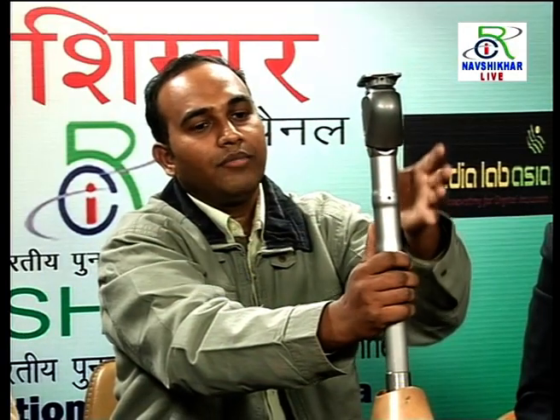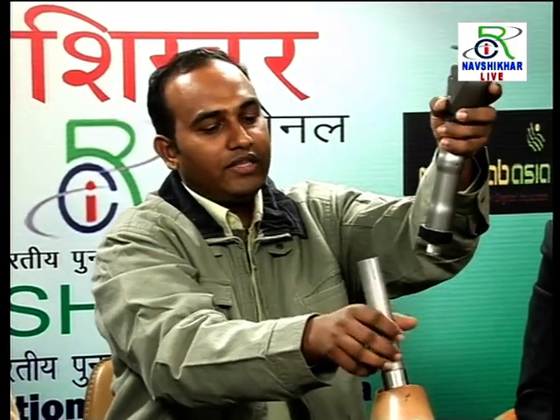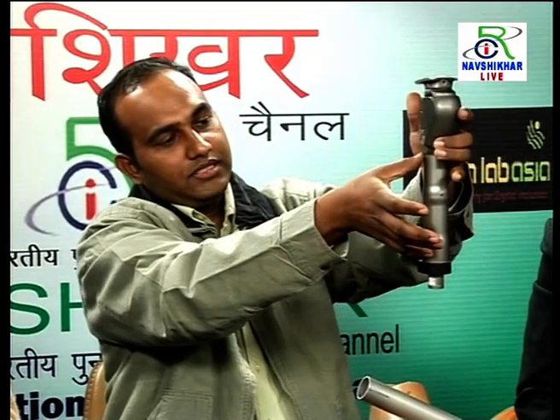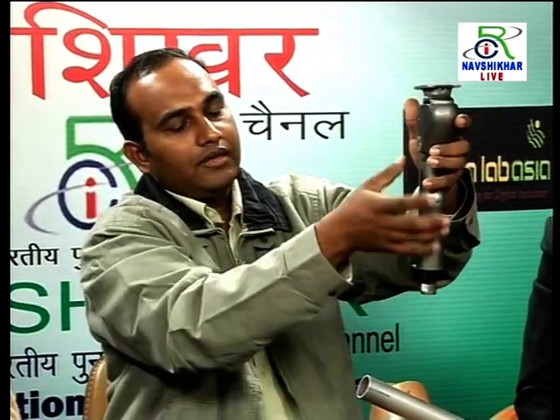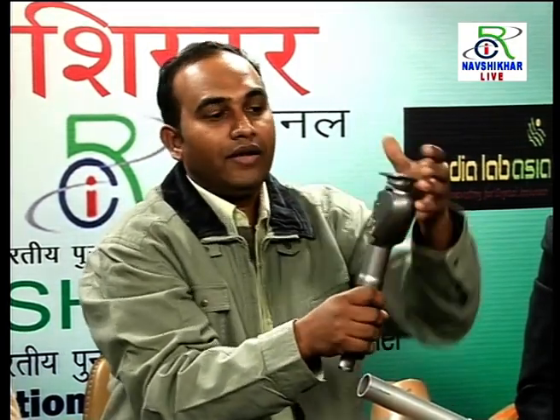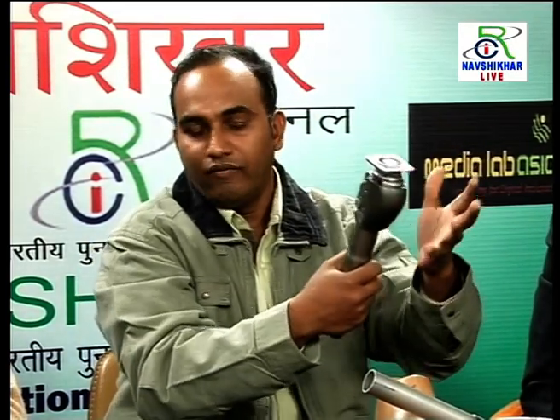Like a hydraulic system, if you see this knee joint, it is a total hydraulic system. It will be filled with oil and a piston, so it will be quite heavy, but it will give you a very smooth movement. So patients who want very smooth movement and are okay with the weight can go for that.